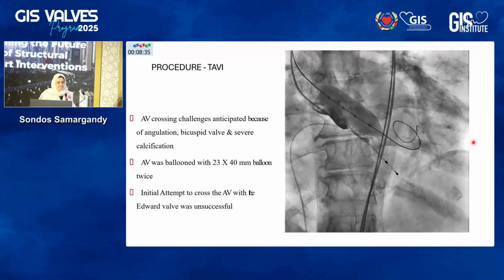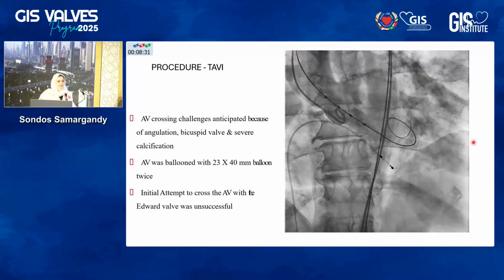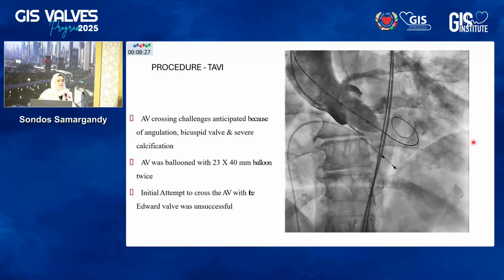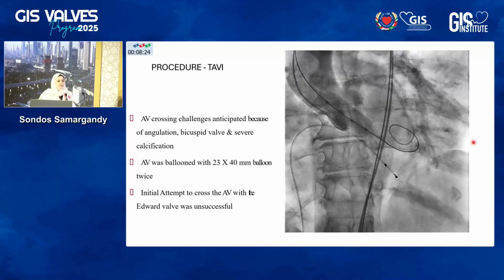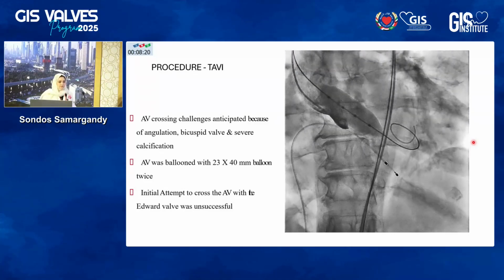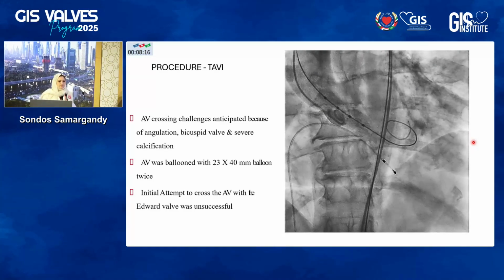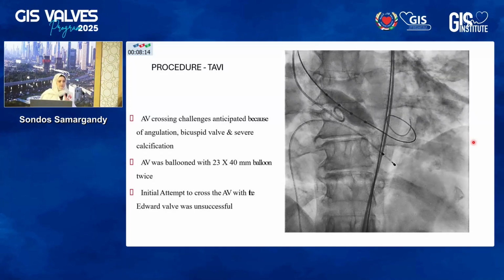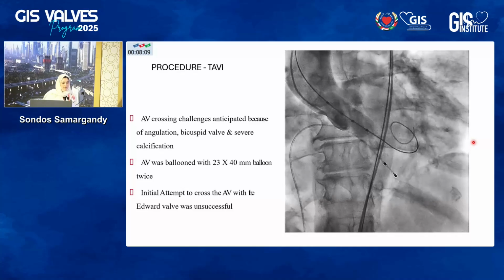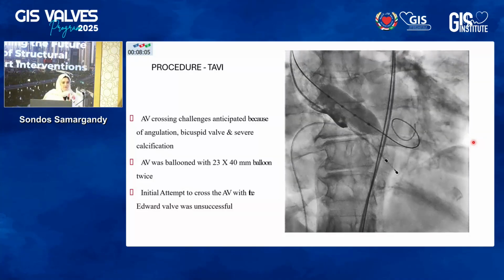So I think again, for the bicuspid, the risk of complications, including annular rupture, has been higher than the tricuspid, so I usually go by the minimal diameter. But I have to say, I do extra work in a bicuspid where I flip the C-arm to look at the balloon expansion in another view, specifically in RAO, in order to make sure that I achieve full expansion. Otherwise, it's not uncommon that I actually upgrade my balloon size to ensure that I prepare the annulus well.